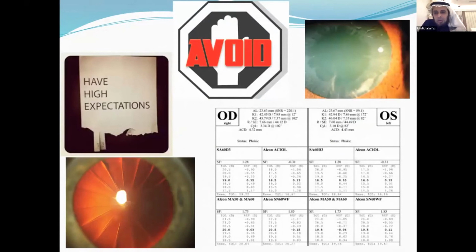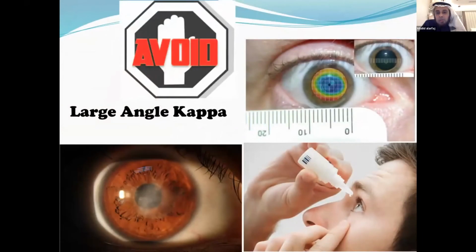Please avoid giving premium lenses generally to very high expectation patients, and RKs, unless you use some sort of EDOF lenses with micro monovision or mix and match in these cases. If you have high cylinder, please use toric lenses for the patient. Avoid patients with very severe dry eye, corneal scarring, very large pupil or even large angle kappa.